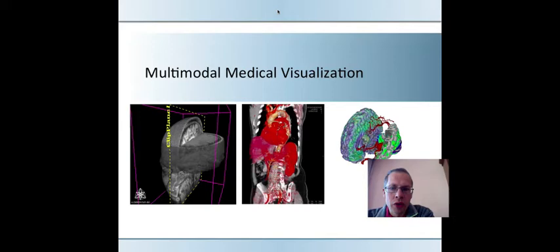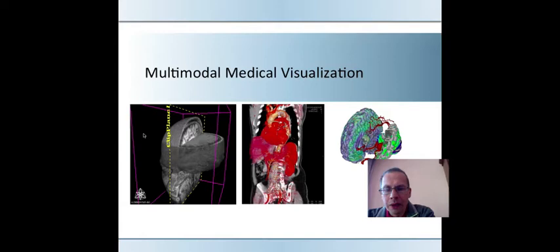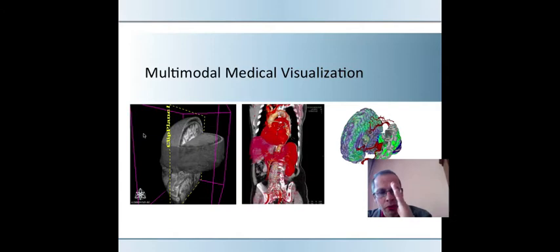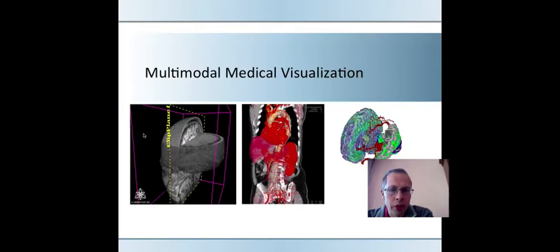I tried to motivate this already with the initial images on the title page. On the left you see an image that is more than 20 years old, so the topic is not completely new. You see parts of a CT data set from the head and parts of an MRI data set of the head, and clipping planes are used to adjust which portions of each are visible. If you interactively handle this with the possibility of making continuous changes to the position or orientation of a clipping plane, that helps to get a better understanding of both data sets simultaneously.